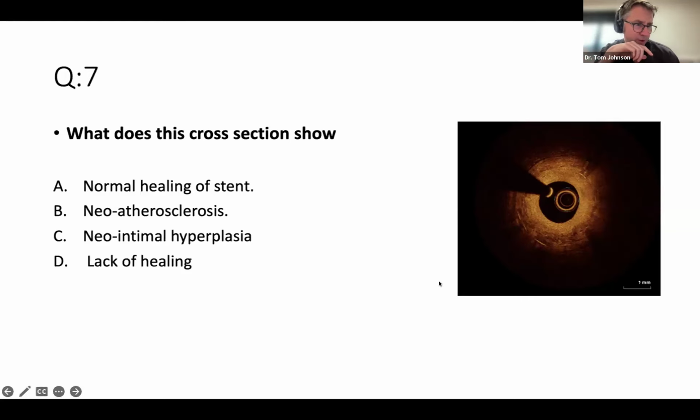Dr. Moser said, I think the time frame is important. And I think that's very reasonable. We'd expect neoatherosclerosis to develop 12 months or so beyond. So if this was an early response, in the first few months, then you're absolutely right. I think you would interpret that area around the strut to be more likely an inflammatory response in the context of a very aggressive neointimal hyperplasia. So the timing, I think you're right, is right. And as Mervat says, the two aren't mutually exclusive.